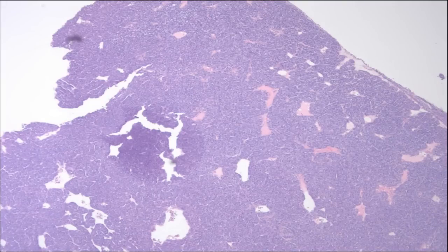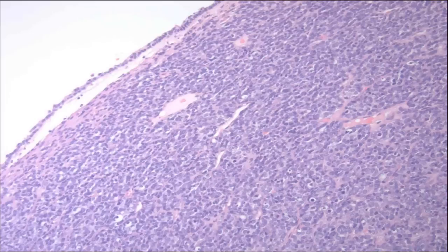We have a very cellular neoplasm. You see right here some intact sinonasal mucosa and a very cellular neoplasm, a lot of vascularity. Actually, you get a little sense at this low power of a nested appearance. So we begin to build a differential as to what we think this could be. Undergoing a little bit higher power, we see this intact sinonasal mucosa, in fact sort of flattened, and then we have these nests of cells, very undifferentiated. You see some mitotic activity, and so it looks like it's very proliferative.